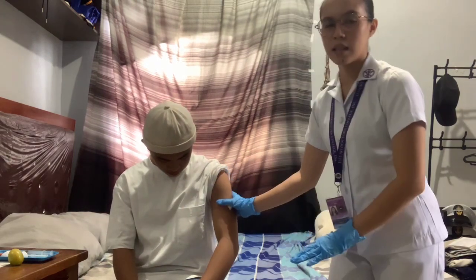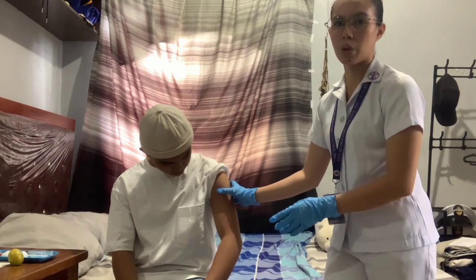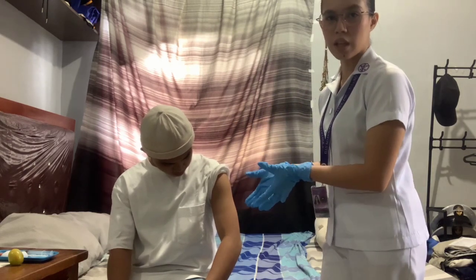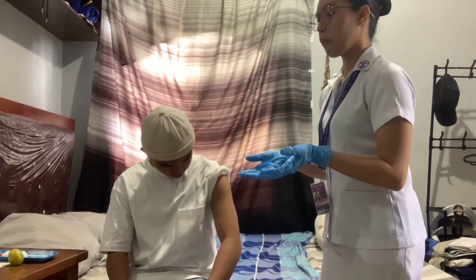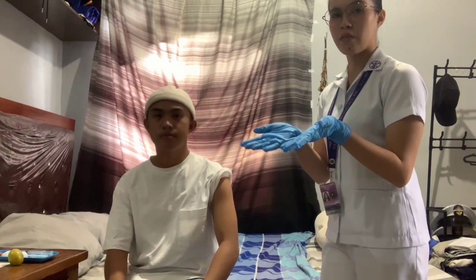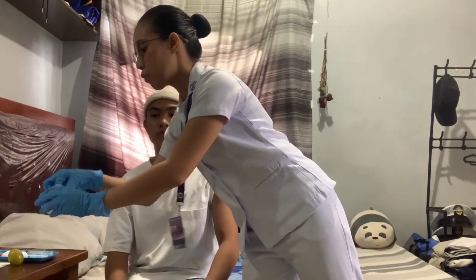So this is the site that I will be injecting. So make sure that we are not using a frequently used site that has already been injected. So avoid using the same site twice in a row. So now, as we have already located the exact site for the injection, and we have already prepared the clean pair of gloves, now we are going to proceed in cleaning the site with an antiseptic swab.